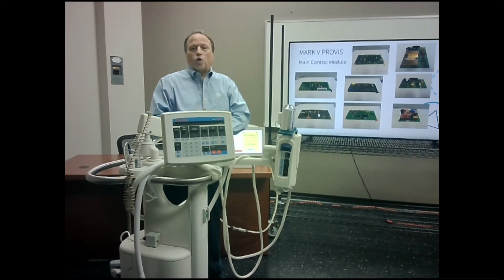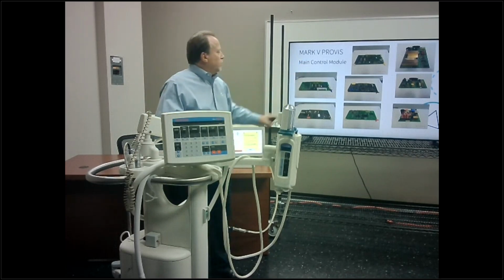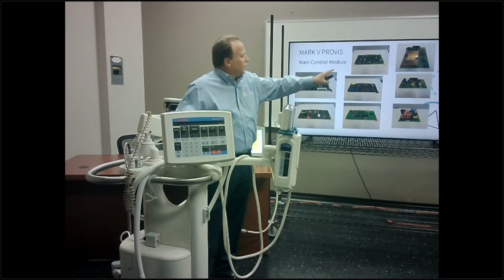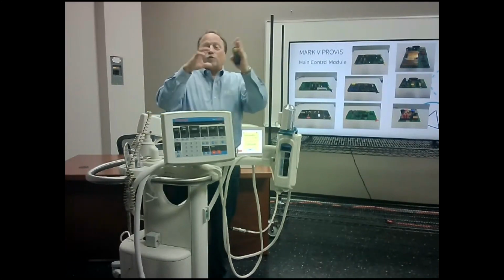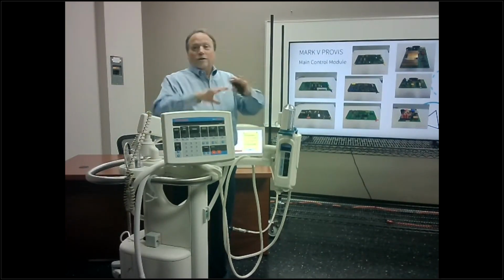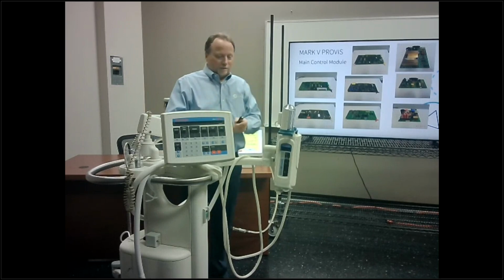Every board has its own function, whether it be an interface board, CPU board, PPI board. That's the back. Interface board, power supply card, mechanical stop card, or the motor relay card. They all do their own little function. Okay? Nowadays, half that will be on one board. This one is not like that. Keep that in mind.